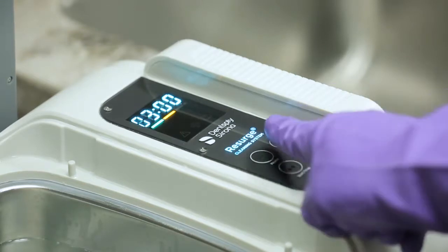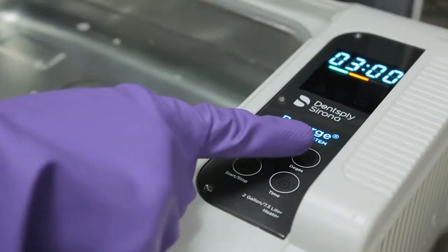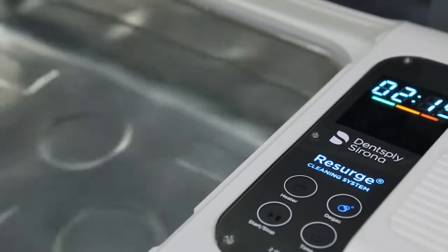The Resurge Ultrasonic Cleaner has a convenient degas cycle which runs for 3 minutes. Simply press the degas button twice. All functions on the Resurge Cleaners require you to press the button twice — this is a safety feature. The system will start and the LED timer will count down.